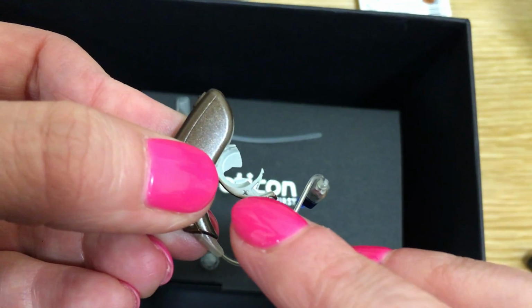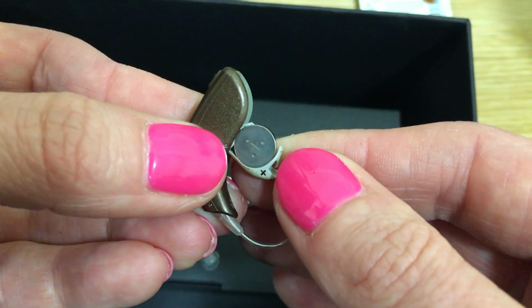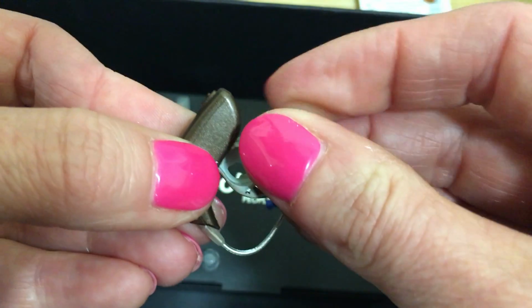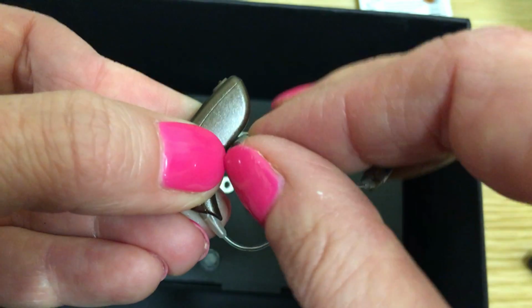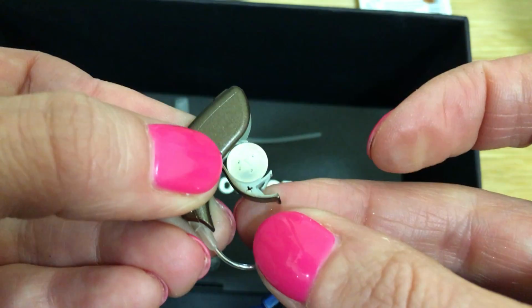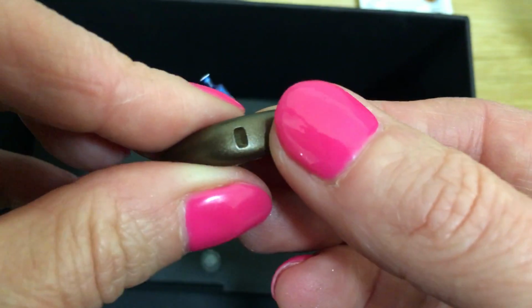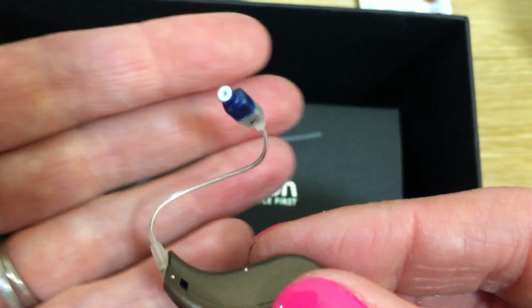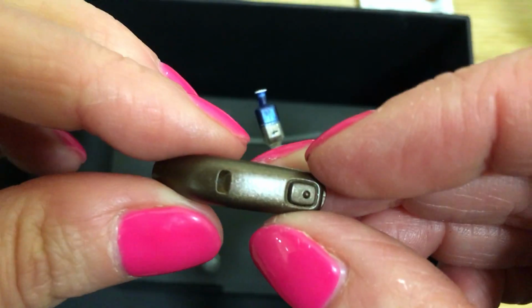You can see a small little cross there, and a small cross on the battery. You want the two crosses facing up. If we put the battery in upside down by mistake, it's very tricky to close the drawer. Switching the instrument on will happen once the battery chamber has been completely closed. We can give the instrument a little squeeze to make it feedback, which will indicate that everything has booted up.